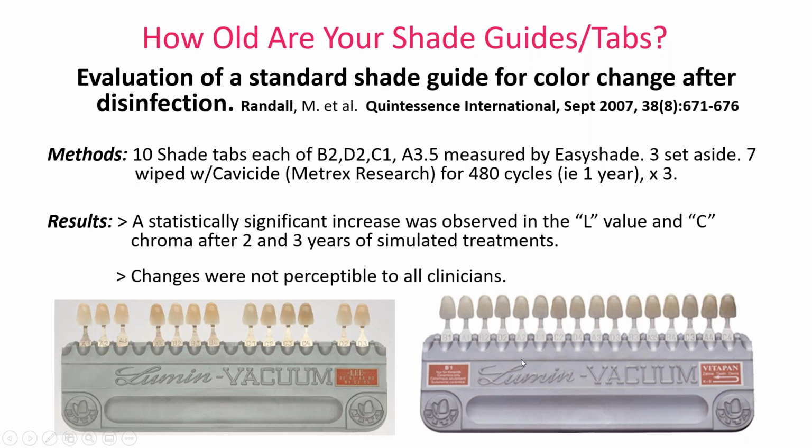Don't use these. These are from a time when VITA produced these, and we actually used stains at the factory and stained the cervical and certain areas of each shade tab. And so those are different than today's modern gold standard shade colors. So over time, your shade guides, after disinfecting them, that luster, that glossiness will be worn through. So, you know, maybe every 2 to 3 years, you should replace this.